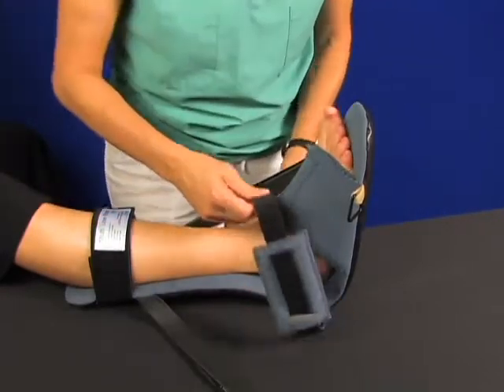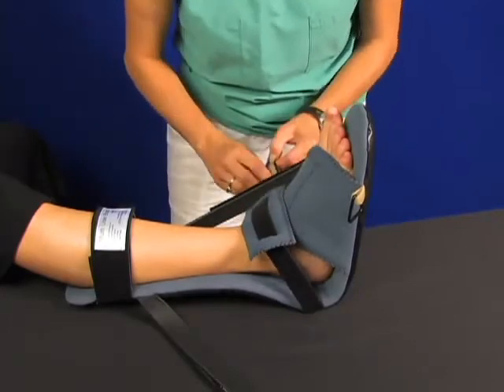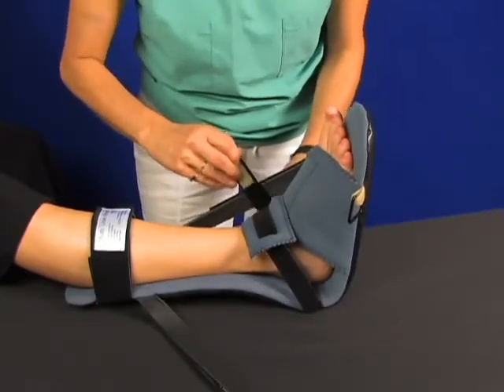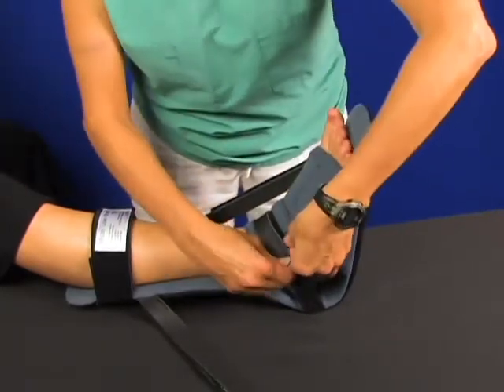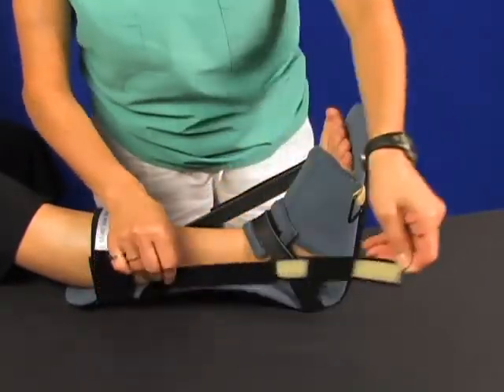Now reapply the instep strap. Carefully adjust this strap and center the pad on top of the instep. The instep strap is required to pull the heel back into the boot and counteract foot drop.